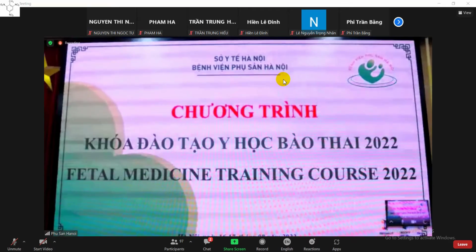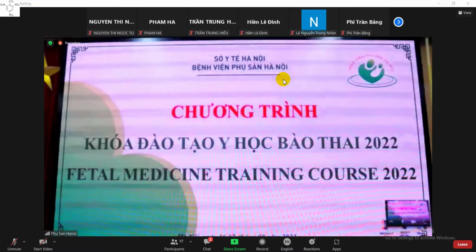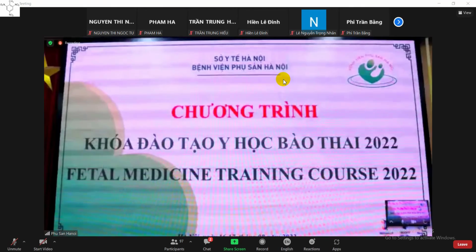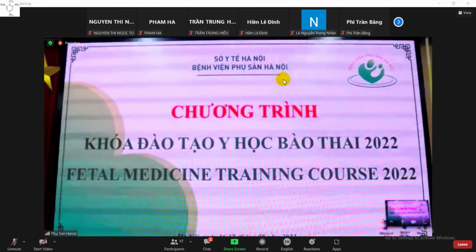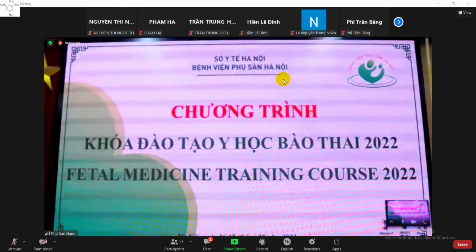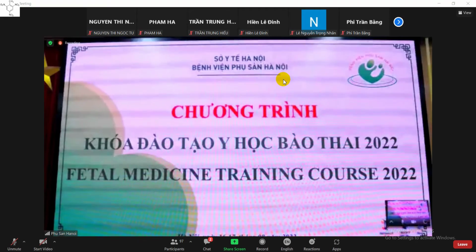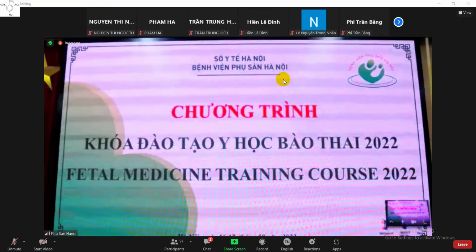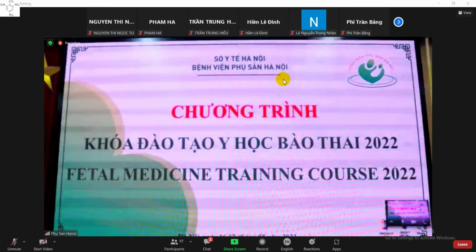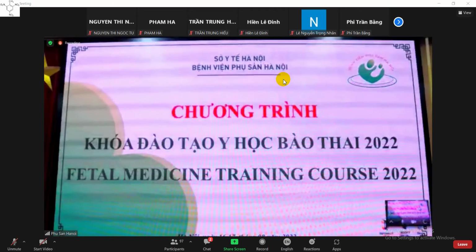But to avoid, obviously, the heart, which is a way away from where you're putting the shunt in, put it in the area where there's a maximum effusion, and only put it in pleural effusions where you think there's significant size. So small rims of pleural effusion are not the cases to start to think about putting thoracoamniotic shunts in. One, because they don't require them, because they're not likely to be associated with cardiovascular or cardiac embarrassment in the fetus. Secondly, they will be technically very challenging. And thirdly, they will be associated with very high risks of pregnancy loss.